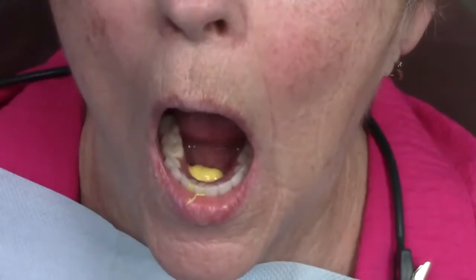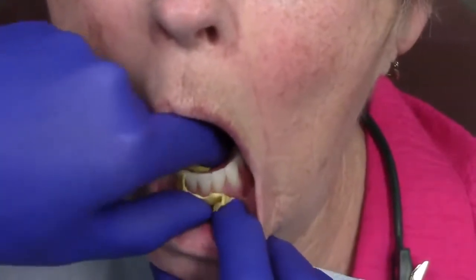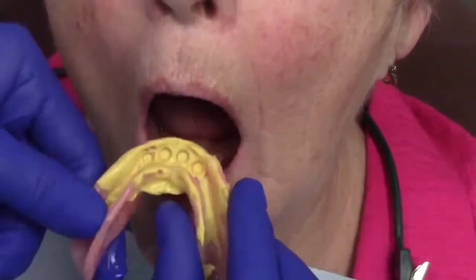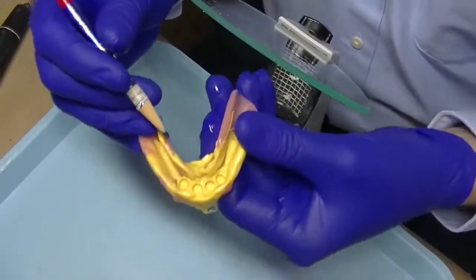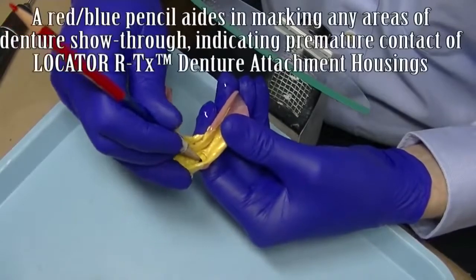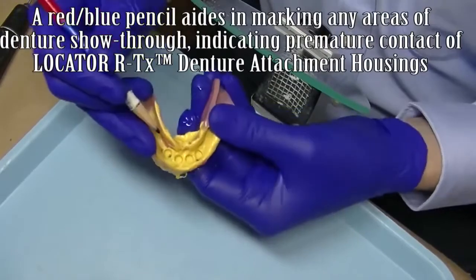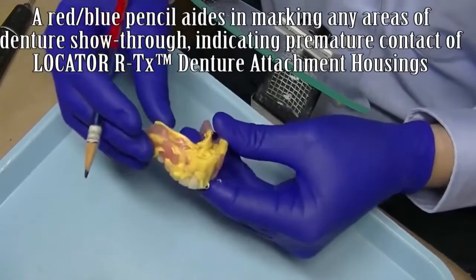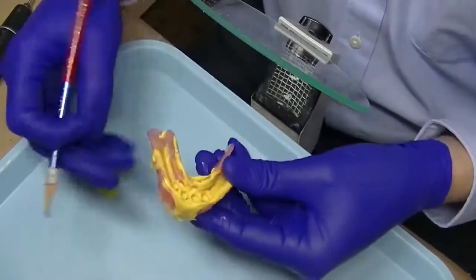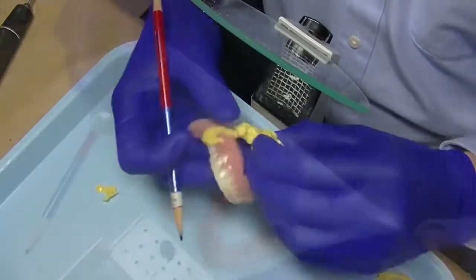This procedure allows you to see if there's any contact of the denture to the Locator RTX housings. The yellow color of the chairside light body PVS contrasts perfectly with the pink color of a standard complete denture. Using the blue end of a red-blue pencil, you can mark any areas that you see pink showing through the yellow portion of the impression material.